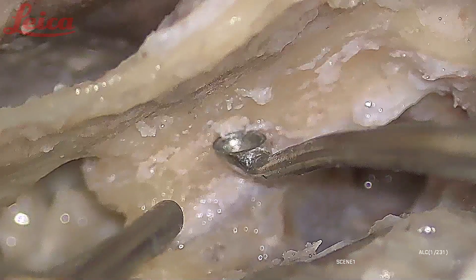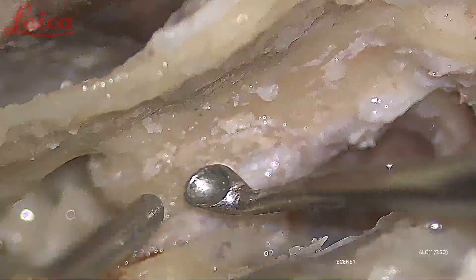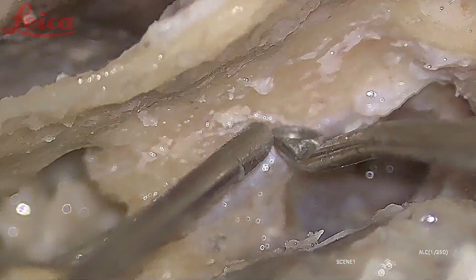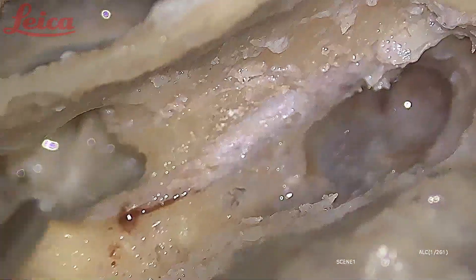This is the origin of the chorda tympani — see how closely it is arising from the stylomastoid foramen area. This is the stylomastoid foramen area. This is the origin of the chorda tympani. Now I am happy with the delineation of the nerve, but to complete the decompression, I always like to incise the facial nerve sheath.